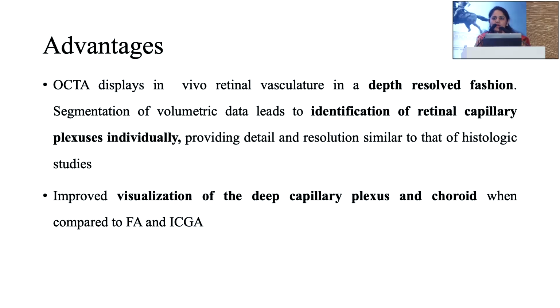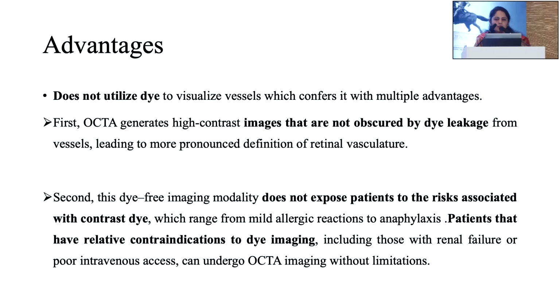Plus, because there is no dye leakage, there is no obscuration of the retinal structures. Also, it not only images the superficial capillary plexus, but the deeper capillary plexus as well. And a better visualization of the choroid is there.